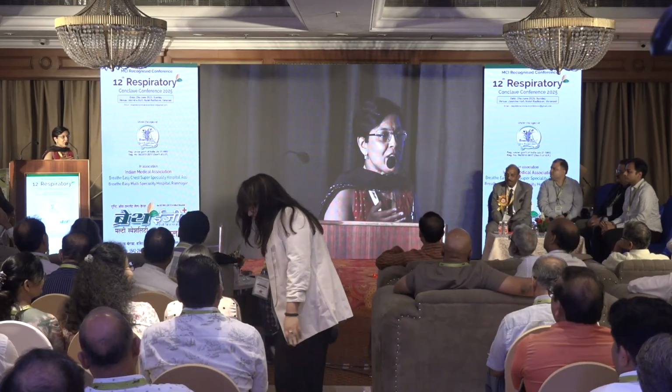No, sir, expiratory film was not done for that patient. I agree with what you are saying. It would increase the yield if you're not able to see it. But I feel that when I have in my hand a modality which is least invasive, no radiation, bedside availability, which has much more sensitivity in diagnosing pneumothorax than a chest X-ray, then I would rather use that. But if it is not available, yes, an expiratory scan would help in diagnosing if we are suspecting.